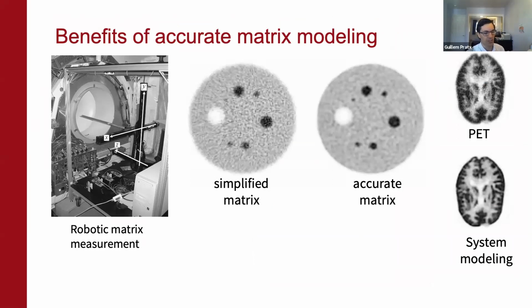So when we do filter back projection, we assume the image acquisition process is this sort of idealized projections where the rays are perfectly thin and perfectly straight and so on. But in reality, because the scanners are constructed using detectors, they're not perfect. The detectors have finite sizes, there's physics going on. And because of that, the images will always have some artifacts in them because of the construction of the scanner and the physics. One way to address those limitations is to actually incorporate these effects inside the system matrix.